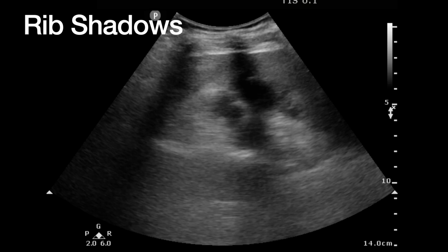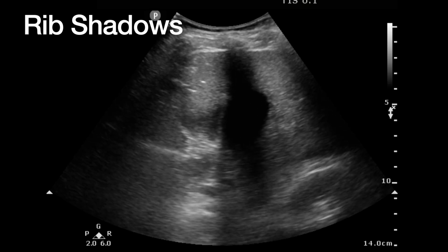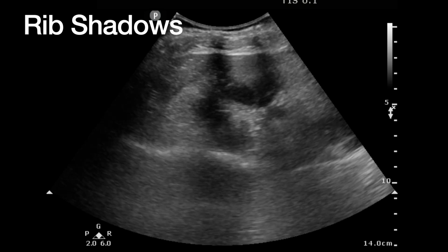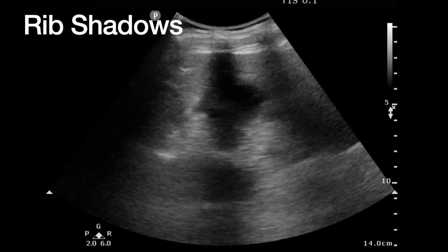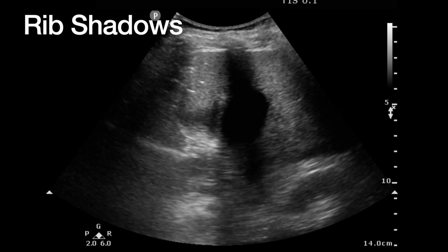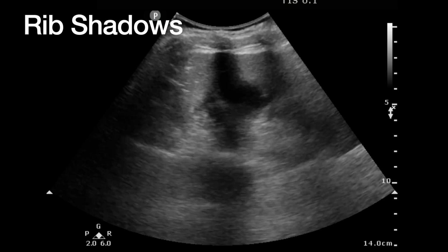The way you do that is to say, hey, take a deep breath, hold that deep breath, and that pushes the gallbladder fossa below the costal margin most of the time, and you get a better view. Now, you have to tell them to take a breath or they don't like it. But you can do this exam in different chunks where you get these different windows, as you're working and coordinating with your patient.